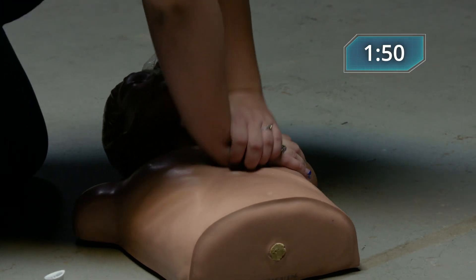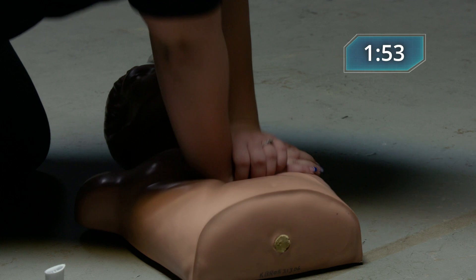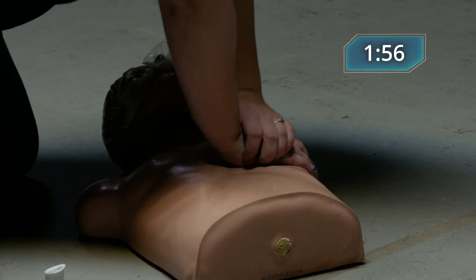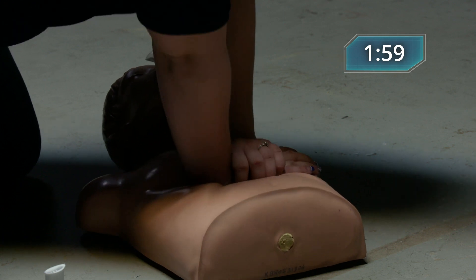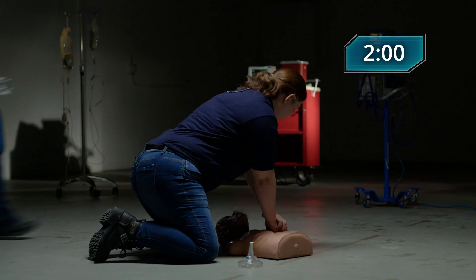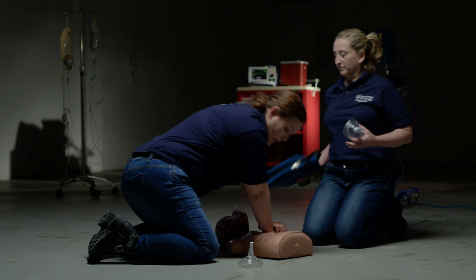One, two, three, four, five, six, seven, eight, nine, ten, 11, 12, 14, 15, 16, 17, 18, 19, 20, one, two, three, four, five, six, seven, eight, nine, 30.